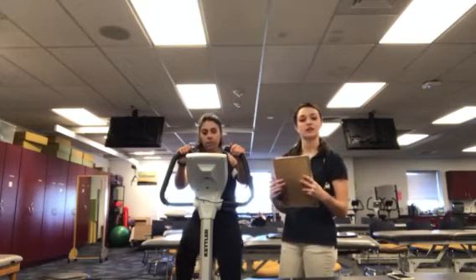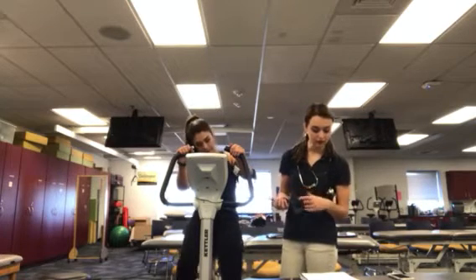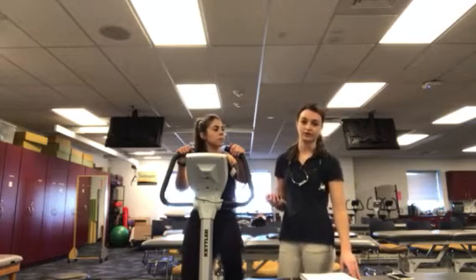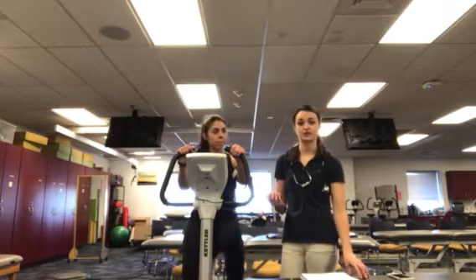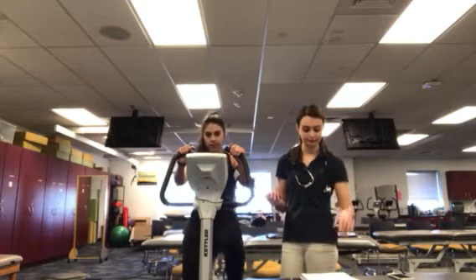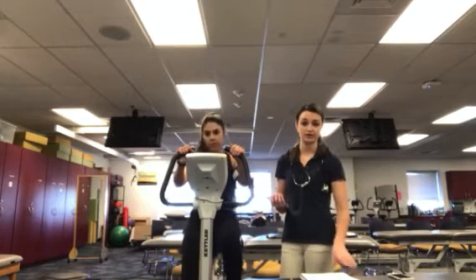So we're entering the next portion of this test where we're going to get our next measurements. I will take those at 5 and 6 minutes. Some instances when I would terminate this test are if Brooke's systolic blood pressure is over 200 millimeters of mercury. I would also terminate if her diastolic blood pressure changes 10 millimeters of mercury above or below what her resting vitals were. Also, if she has any adverse signs or symptoms, I would terminate the test, as well as if she requests to stop for any reason.